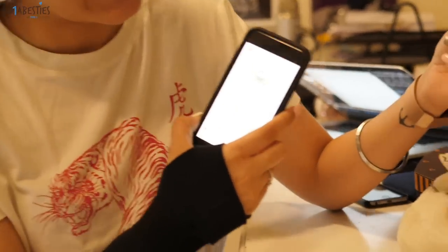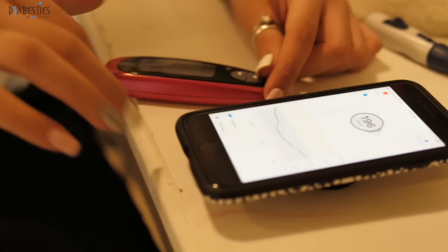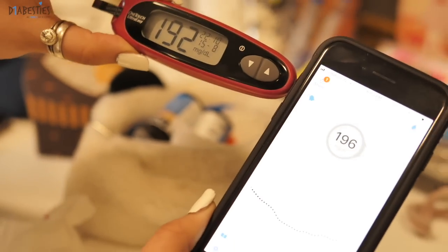Now normally even glucose meters have like a 10 to 20 point difference, so I'm hoping it's not too far off. My Dexcom says right now it's 196, and my glucometer says 192 — so it's just a four-point difference, which is incredible! You can further improve this accuracy by calibrating it on the device. I was expecting like a 10-point difference, but this is super good news — it is extremely extremely accurate. Wow, this just makes me so happy.